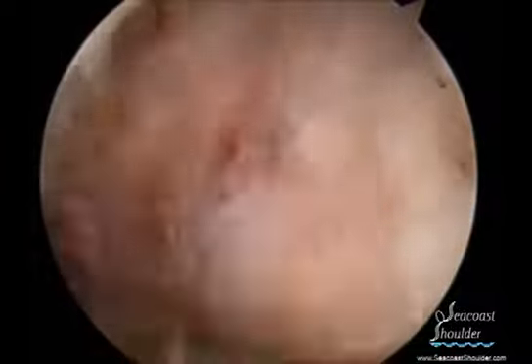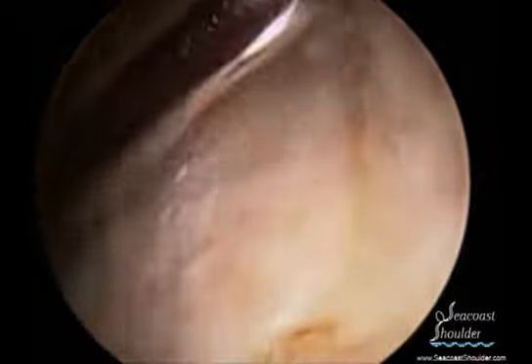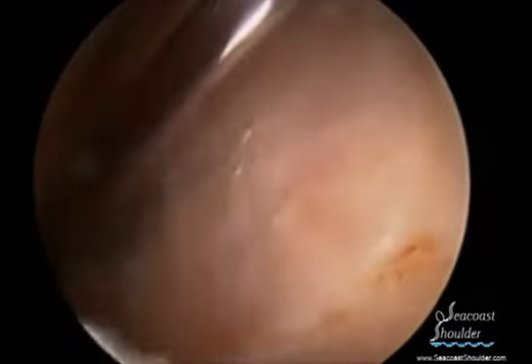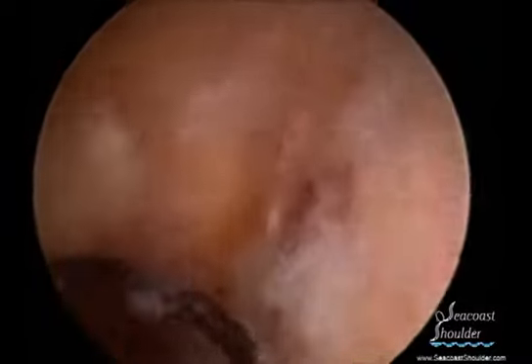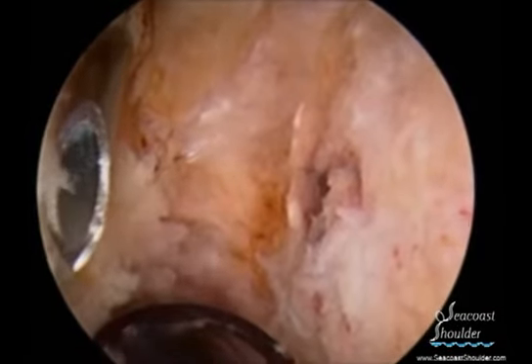At the end of the procedure, two needles are brought in to the joint, each needle tangential to the acromion and to the end of the clavicle. And assuming that the needles are parallel, we can measure the distance between the needles, which will tell us the distance of our resection.